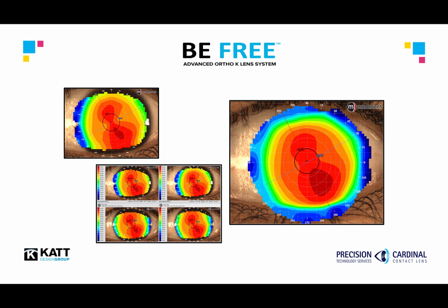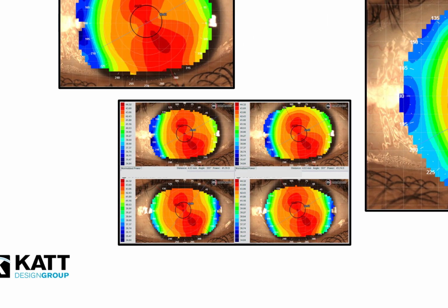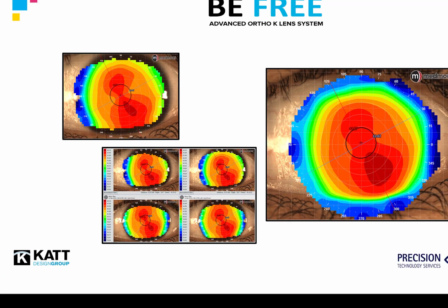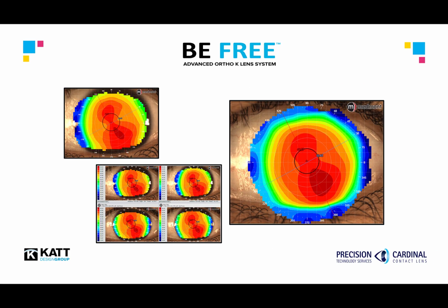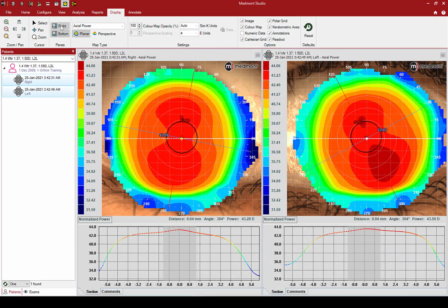When taking the initial pre-fit topography captures with your patient, always take multiple images. When the maps are reproducible, that gives you confidence that you have an accurate corneal topography. Medmont users have the benefit of the proprietary composite eye capture, which allows you to image 100% of the cornea from limbus to limbus. And this is the recommended baseline capture that you should take prior to starting in orthokeratology and with the BE FREE system. No other system works more efficiently with the BE FREE than the Medmont corneal topographer.